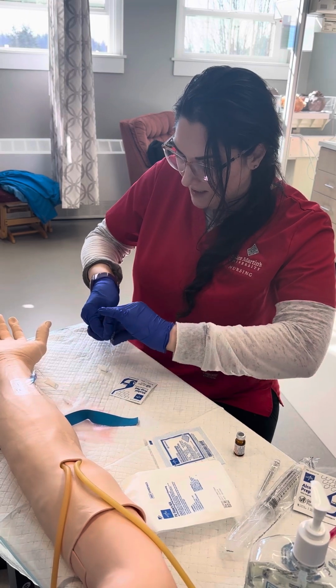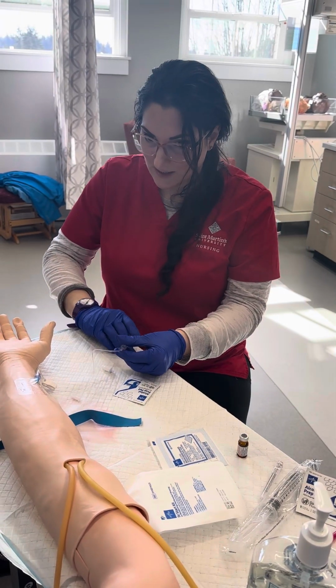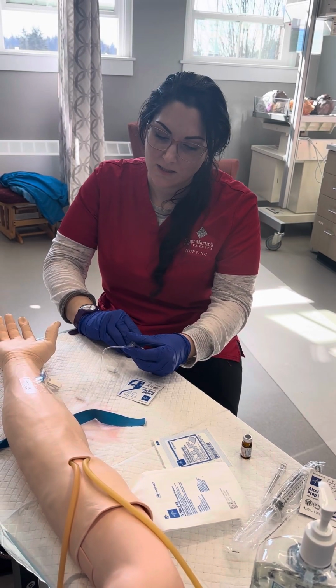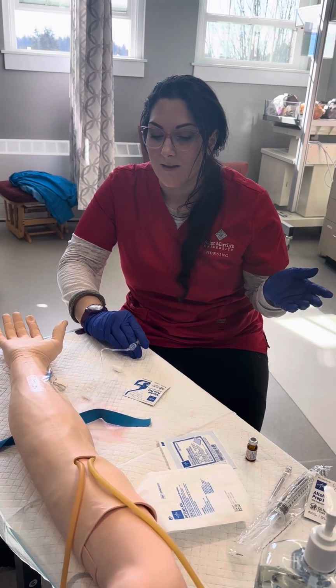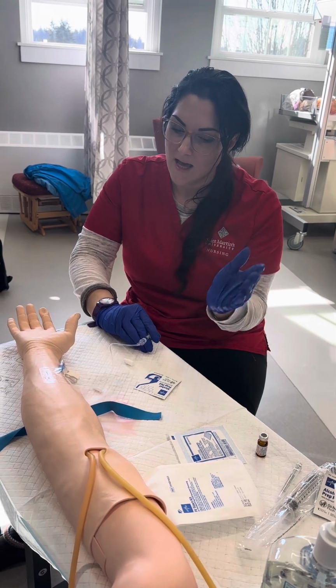I'm going to administer this over 3 minutes, and I'm going to provide teaching to the patient, make sure that he's tolerating the medication appropriately and assessing the site.